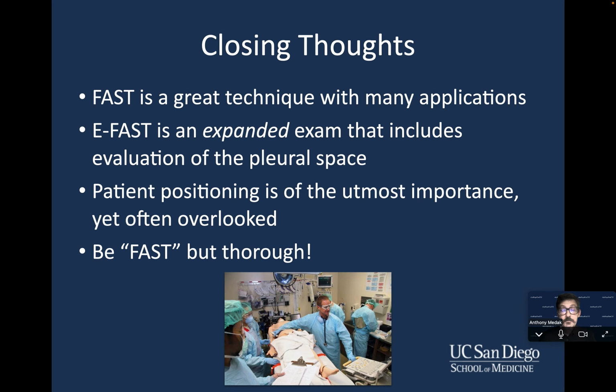At the end of the day, you want this exam to be fast, but you also want to be thorough. So the trick is with practice, trying to walk that line of being quick, but also being good.